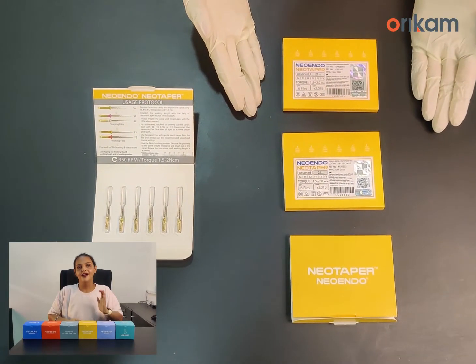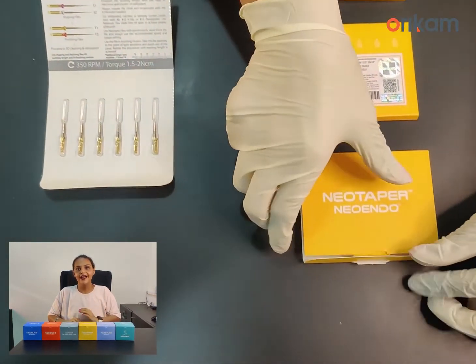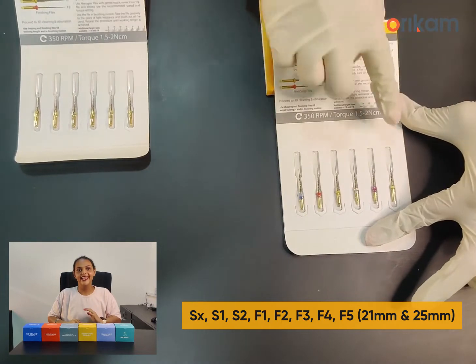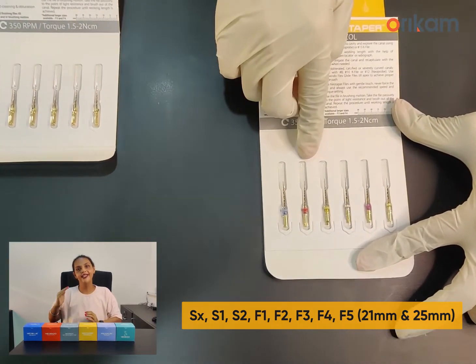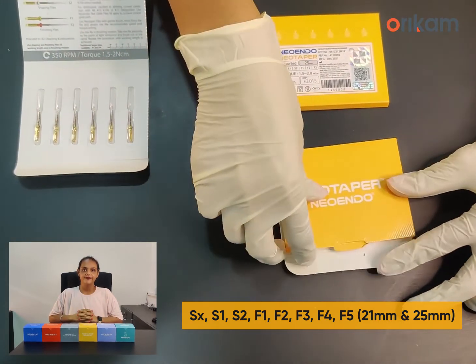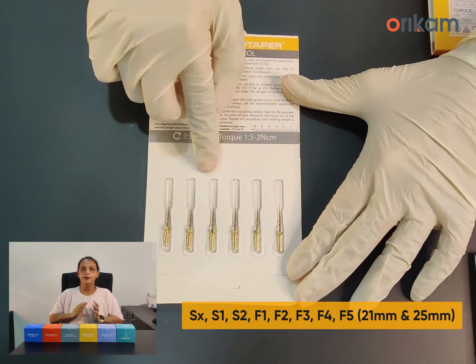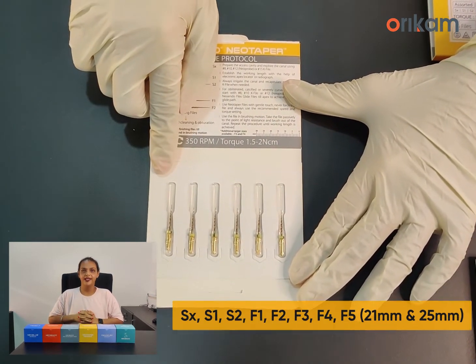NeoTaper file system is available in assorted and refill packs. Assorted packs consist of Sx, S1, S2, F1, F2, and F3 in 21mm and 25mm length. They also come as refill packs where each pack consists of 6 files, both in 21 and 25mm length.